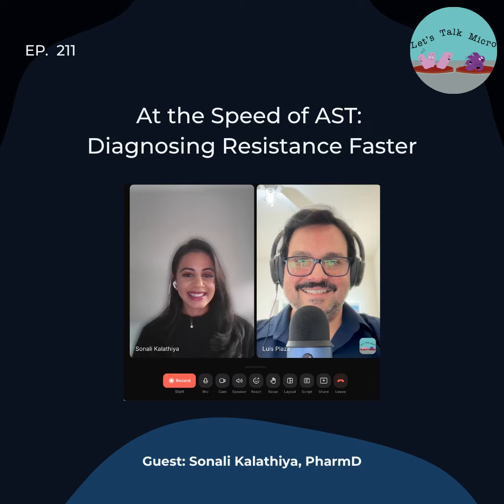The only nuance there is that you might not need identification prior to setting up the fast AST test, but you just need to confirm it before the results are reported. So that can be done in parallel or sequentially, depending on what your lab workflow ultimately ends up being. But you do need the identification at some point before the results are available.